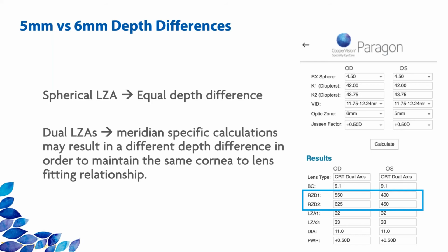But most of them do not know CRT enough to know that a 5.0 OZ has a shallower RZD. So they are still sort of blinded from the treatment allocation. But for me, even though knowing the difference in the design, I sometimes cannot tell the difference on the fluorescing patterns. And especially for CRT lenses, we all know that it tends to blend in terms of the clearance under the return zone.